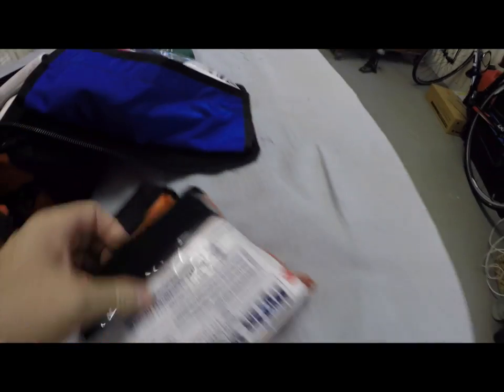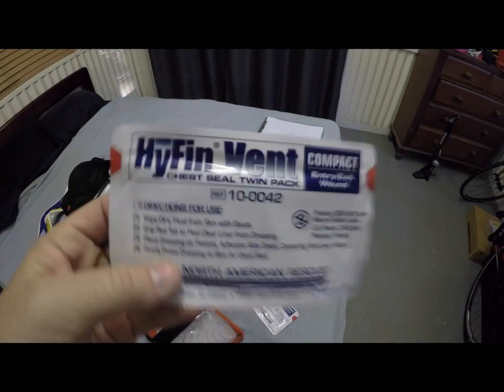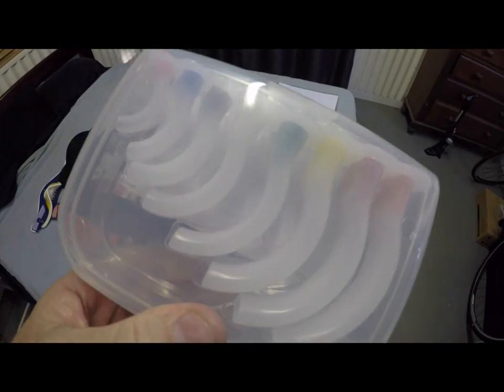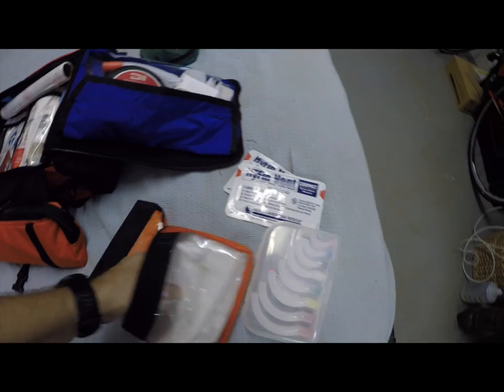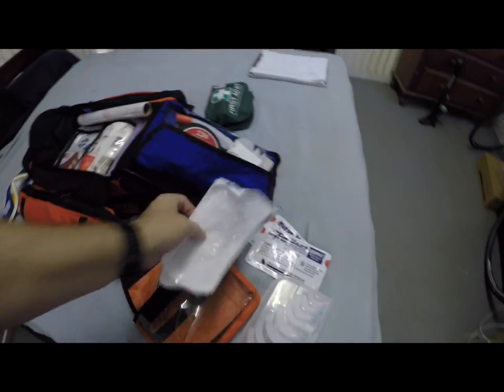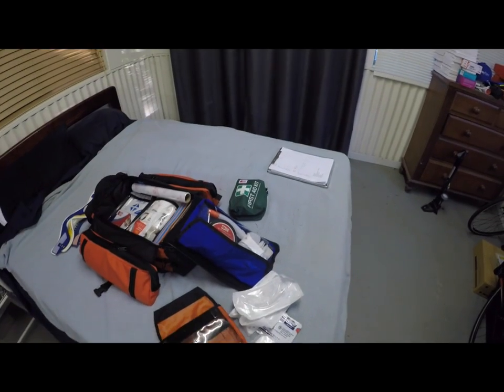In this bag we have two chest seals, which are very cool — I'll do a short video on how these work. We have a complete set of OPAs, from the small ones all the way to the big ones. We also have several NPAs that your EMT students and nurses should know about, and I'll do a video on that too. Lastly, we have a tube of KY jelly, which we use with the NPAs.